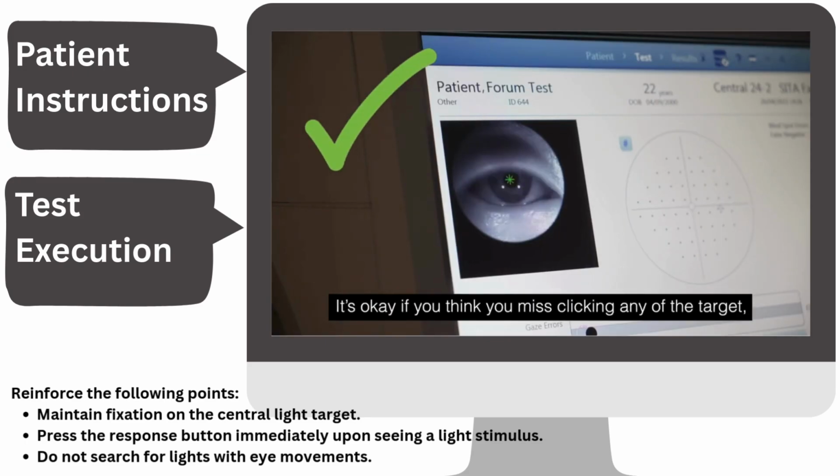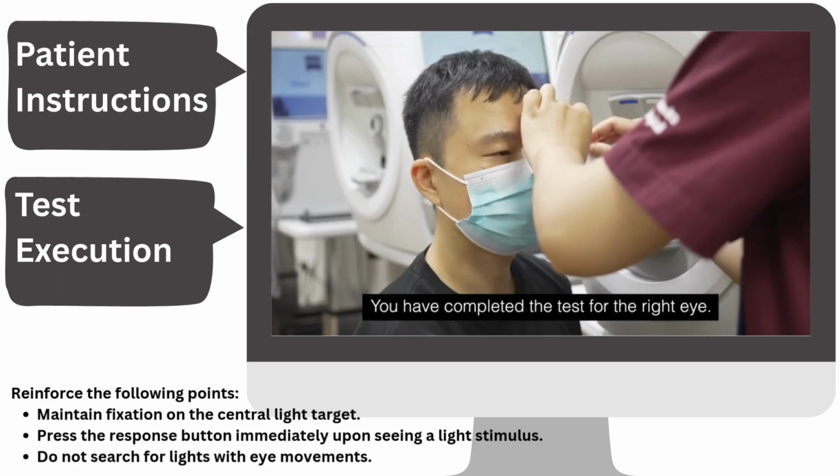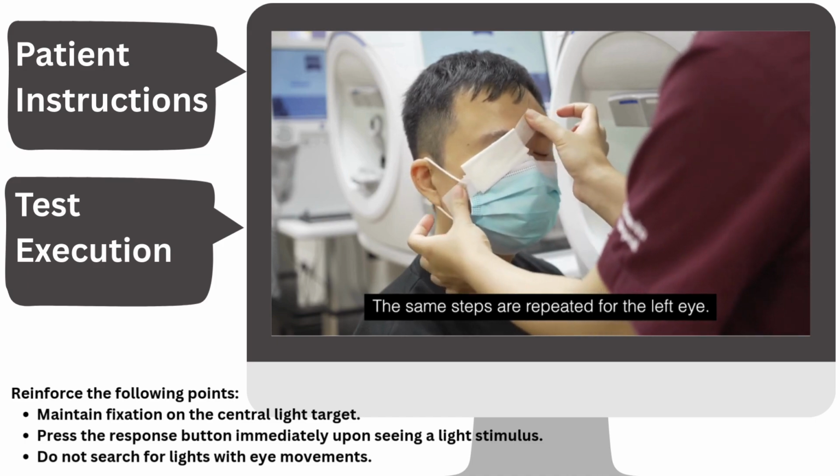It's okay if you think you missed clicking any of the targets. You can proceed with the test. You have completed the test for the right eye. The same steps are repeated for the left eye.